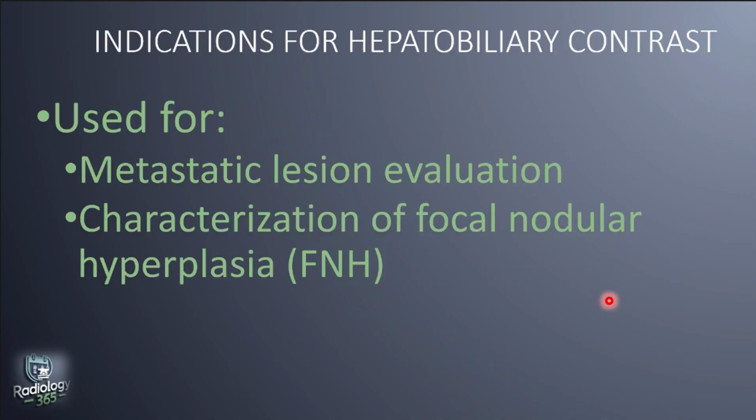Eovist is especially helpful in evaluating focal nodular hyperplasia since it shows uptake in the hepatobiliary phase, unlike most malignant lesions. And it's also useful for metastatic workups, helping us identify and characterize liver lesions that might otherwise blend into the parenchyma.